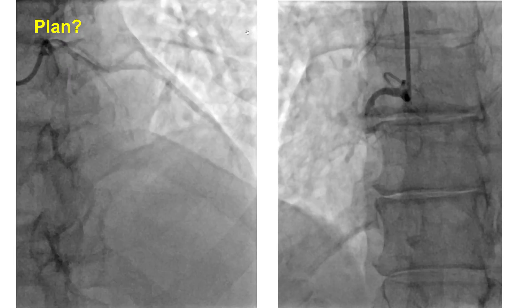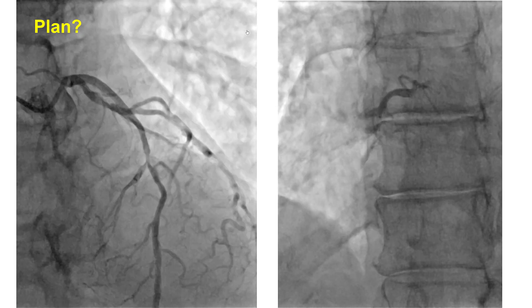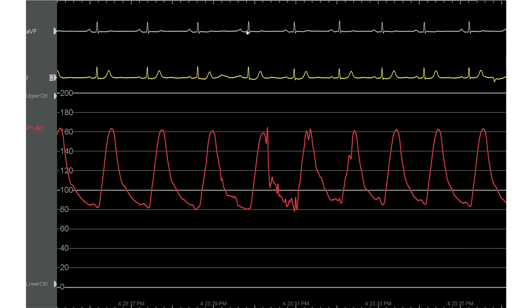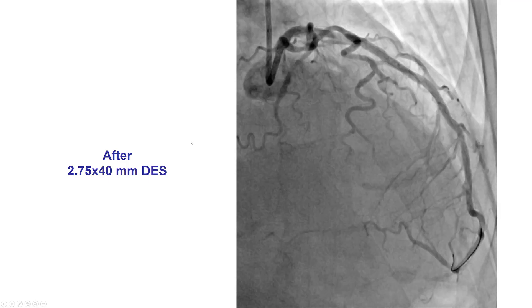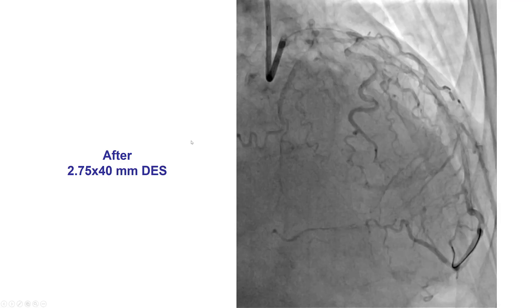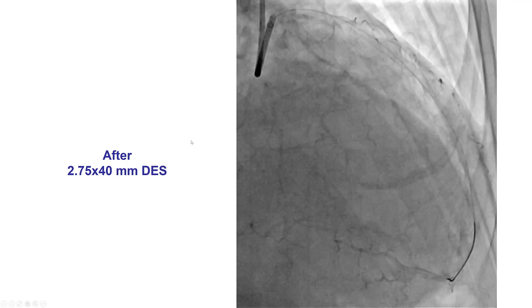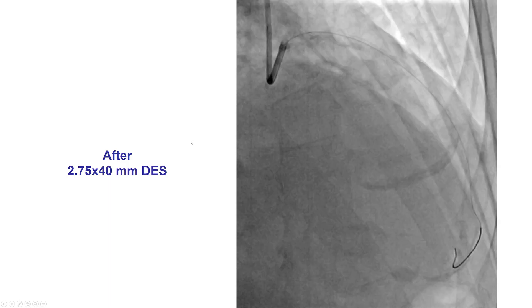As a result, there was referral for Percutaneous Coronary Intervention. These are the baseline hemodynamics and EKG without significant changes and with a good systolic blood pressure. The case was done using radial access and six French guide catheters.